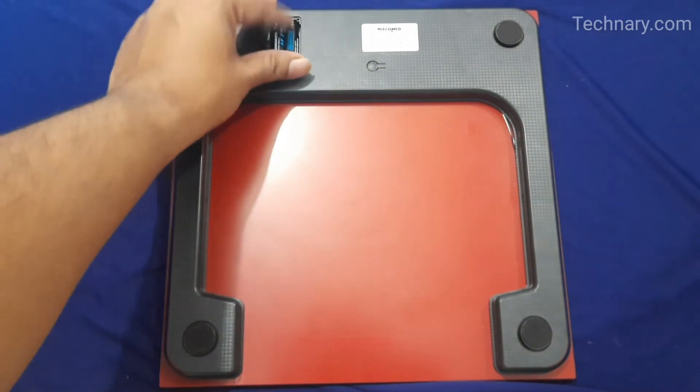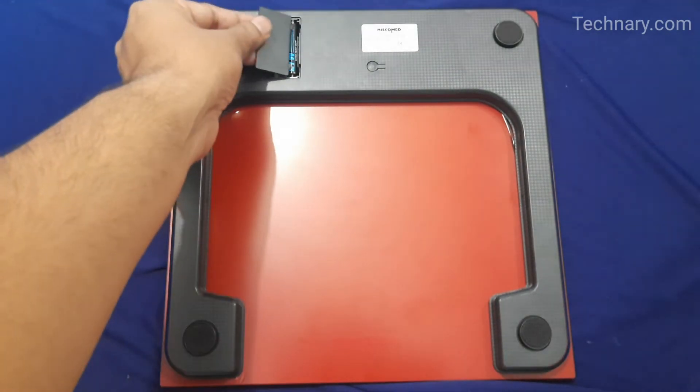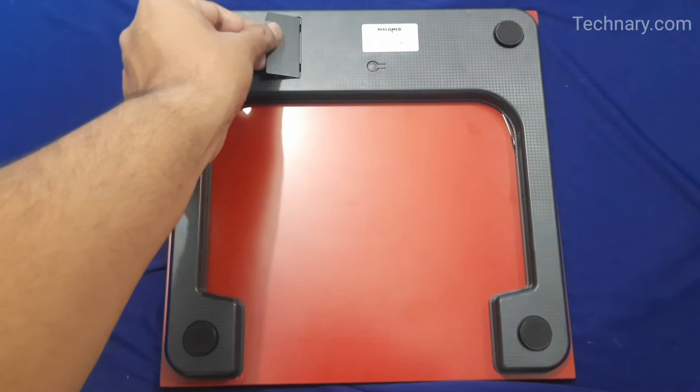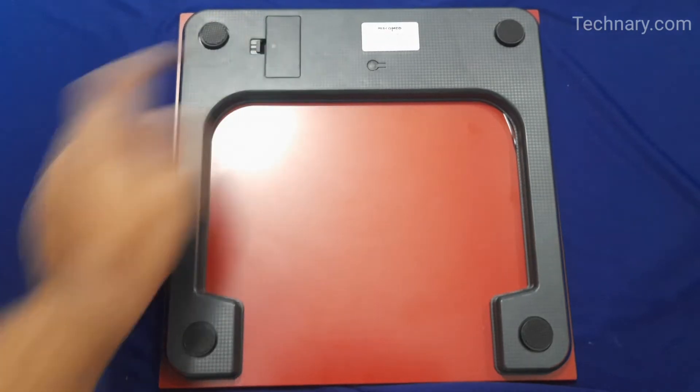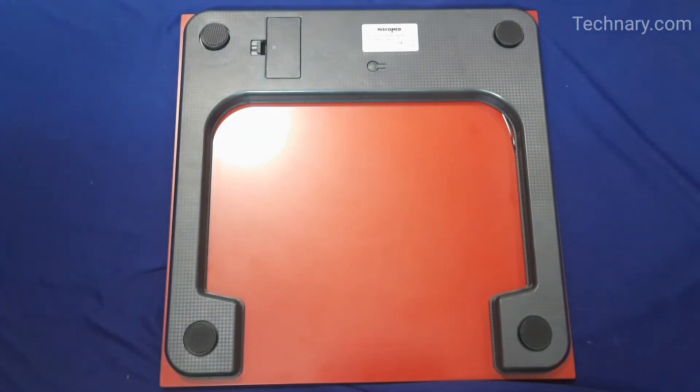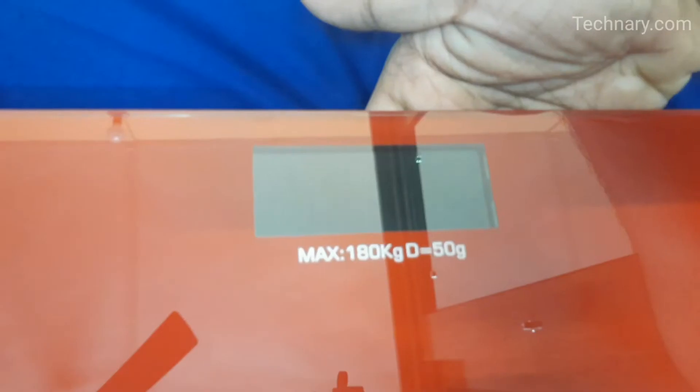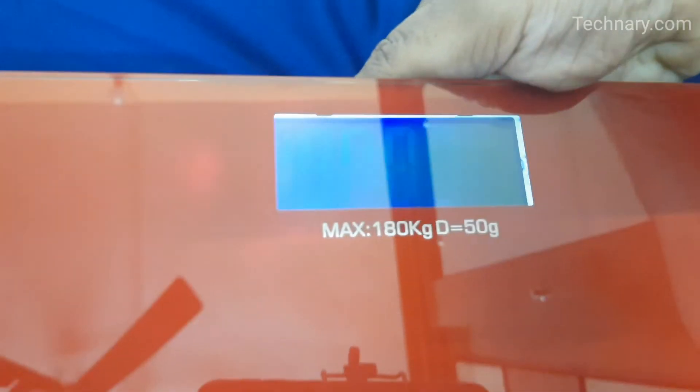The product was well packaged so it came in very great condition. Placing the scale on a hard flat surface will ensure the greatest accuracy and repeatability. Always weigh yourself on the same scale placed on the same floor surface. Uneven floors may affect the readings.